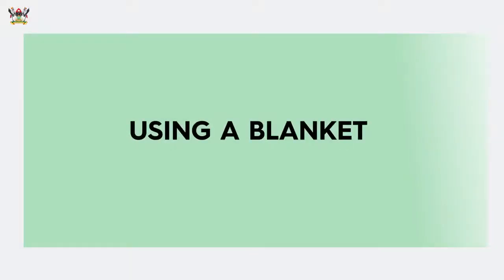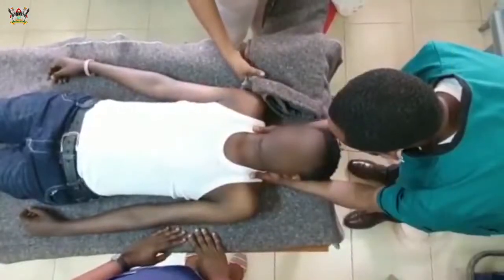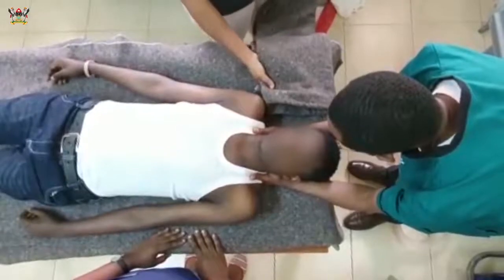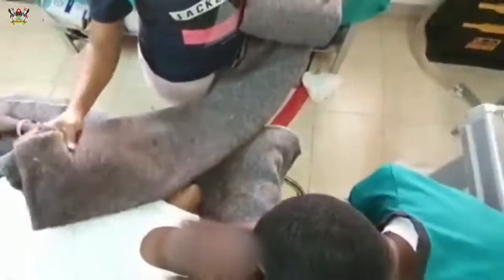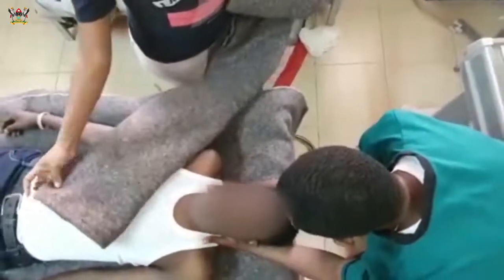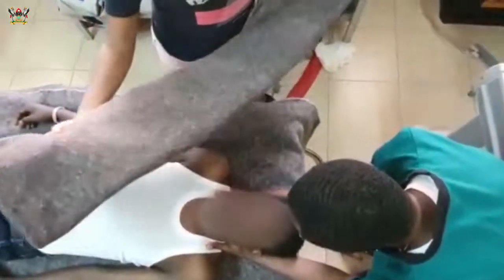In absence of a rigid neck collar, we can improvise with other materials. In this video, we are going to demonstrate stabilization of the cervical spine using a blanket. This is a normal blanket — we've just folded it to make it this size in order for it to help stabilize the neck.